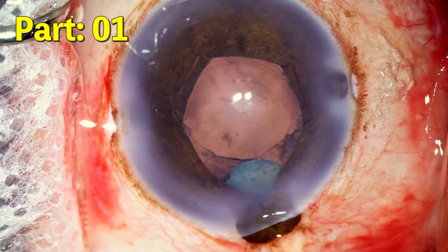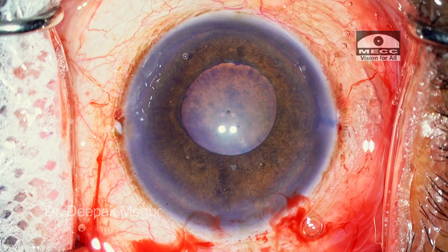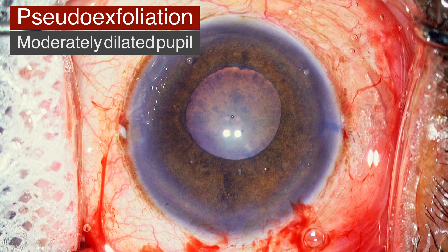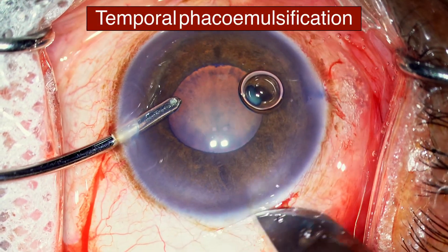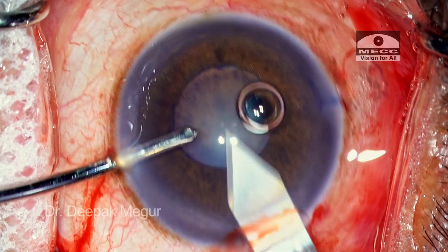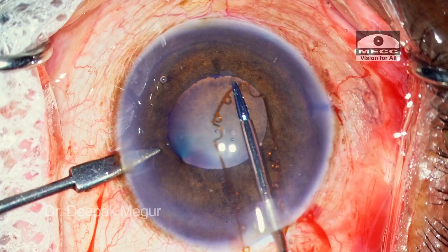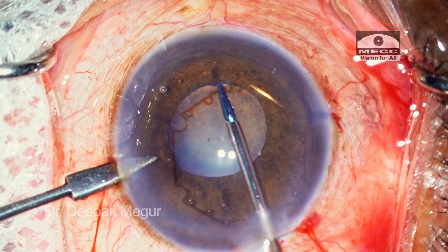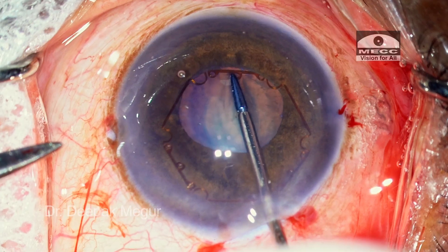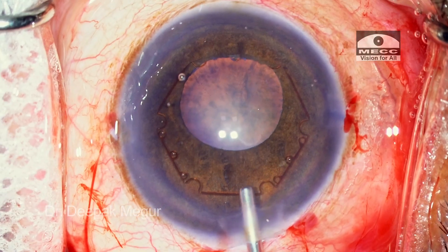The first part will show an event which happens and we'll try to analyze how it could have been prevented. This is a young colleague of mine who is operating on an eye with pseudoexfoliation, non-dilating pupil, and she's sitting temporally performing phacoemulsification. She has performed around 120 phacoemulsification surgeries and has reasonably good surgical skills. Let's try to analyze when things don't go as we plan — decision making is hampered because our brain is clouded during that moment.